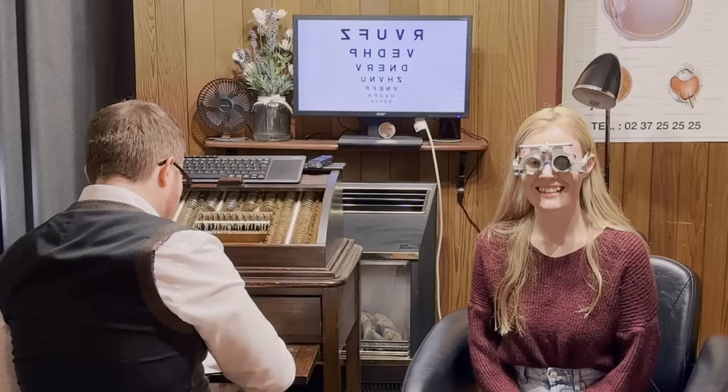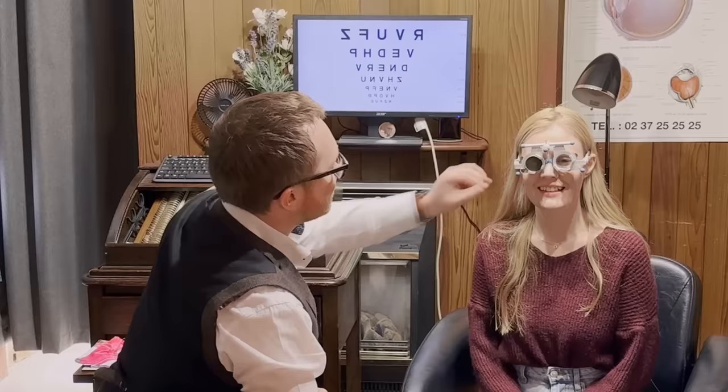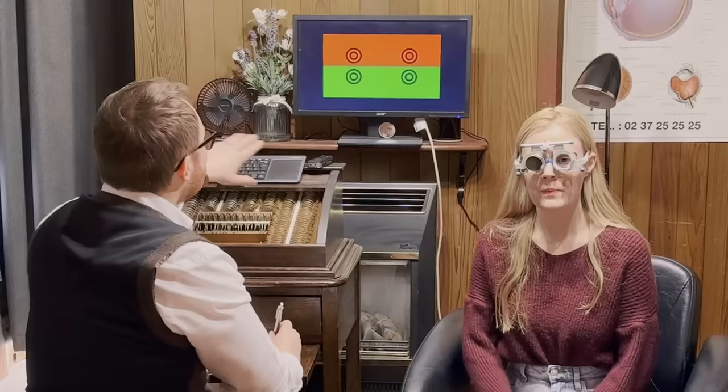Now, we're going to have a look with your other eye, so we'll give that right eye a bit of a break. Have a few blinks. It might take a second or two for your left eye to wake back up. That's perfectly normal. So we'll start off just having a look quite generally with the circles on the red and the green. How are they looking? Would you say clearer, more defined on the red, the green, or about the same? Yeah, I'd still say the red. Yeah, okay.